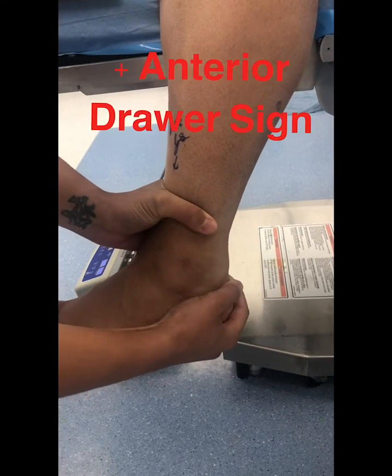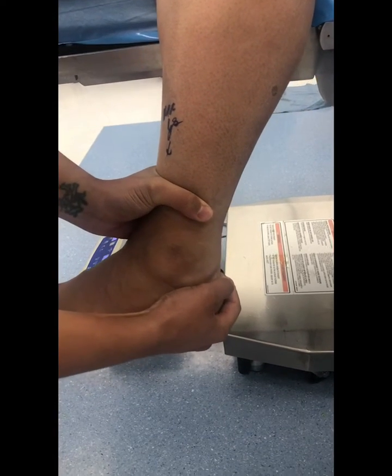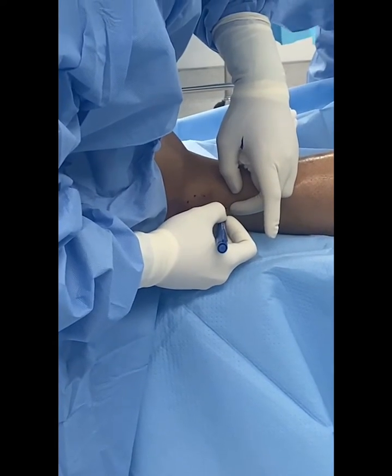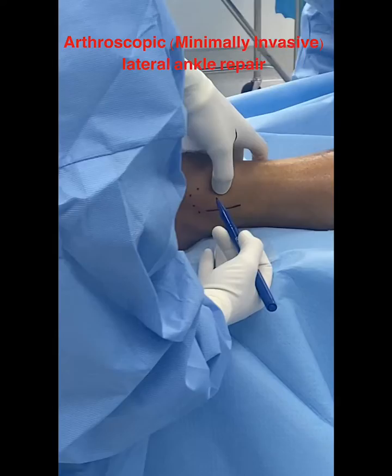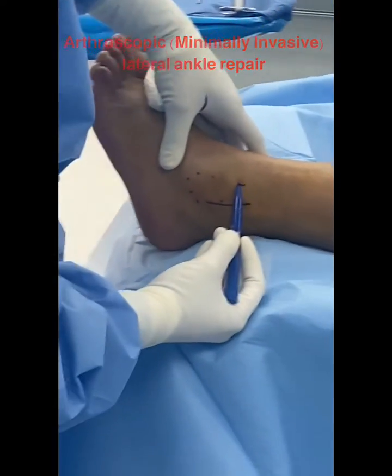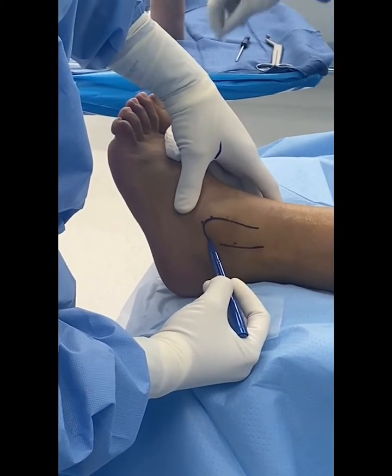This patient has chronic lateral ankle instability. They have a positive anterior drawer sign indicative of ligament injury. What I'm going to do for this patient is an arthroscopic minimally invasive lateral ankle stabilization, also known as a Brostrom-Guhl procedure.